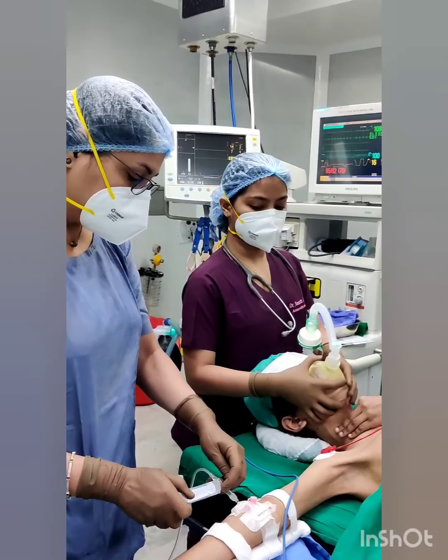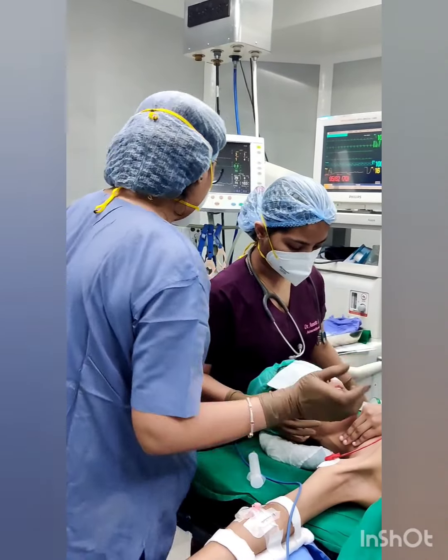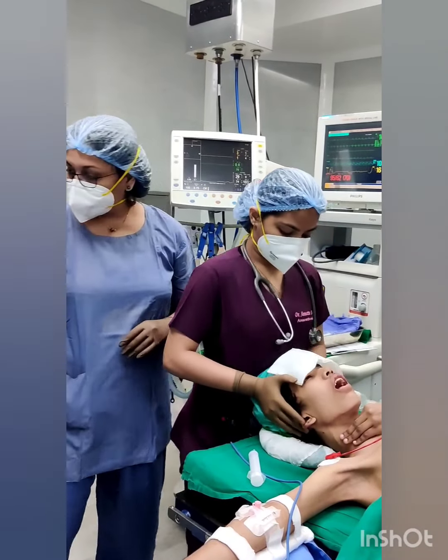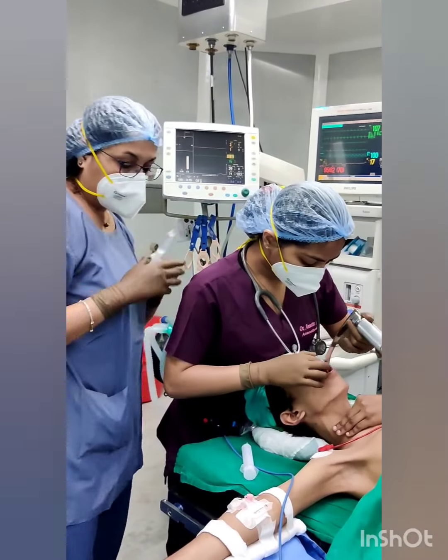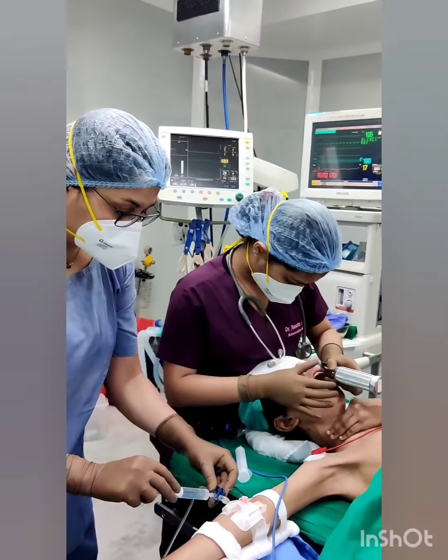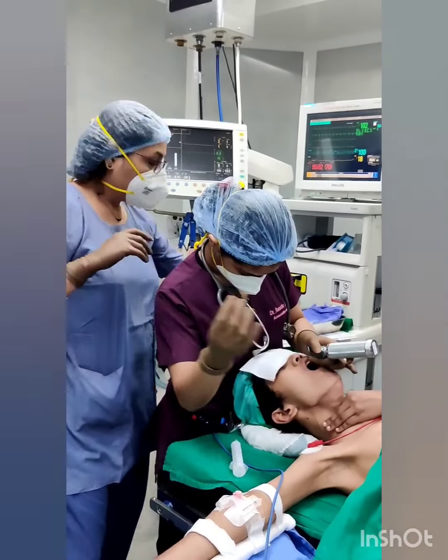If you give IV succinylcholine, wait till the fasciculations have passed away. However, sometimes fasciculations are not seen, especially if you have given a good dose of induction agent. Also, with IV rocuronium, there are no fasciculations. After 60 seconds, the patient is optimally paralyzed. Perform the laryngoscopy and intubate the patient.